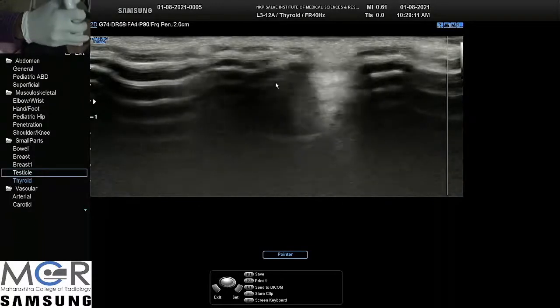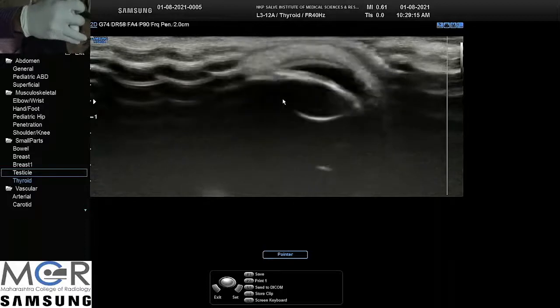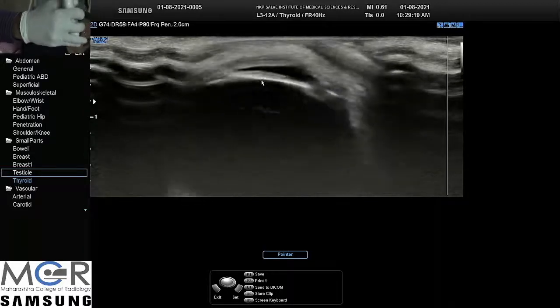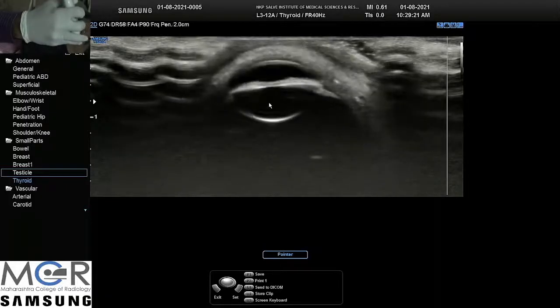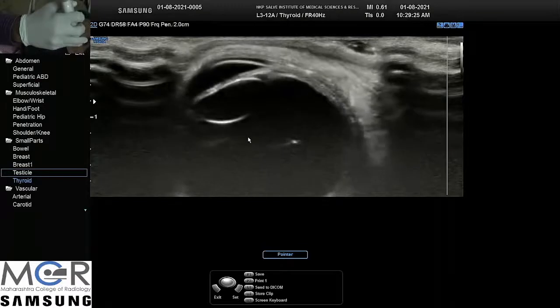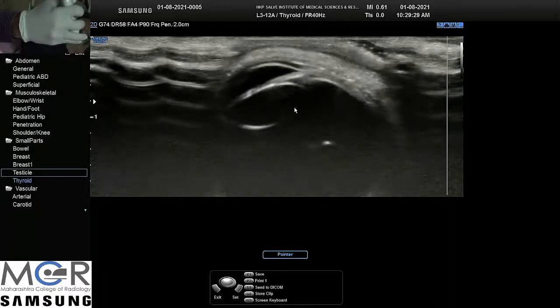Turn the eye outward to this side. Yes, that's it. So he is quite obedient. We can see the iris and ciliary body on this side as well. What is the clinical finding here? Okay.